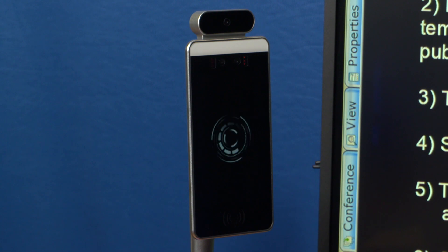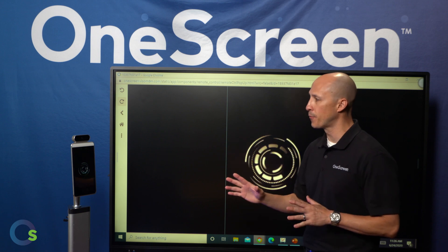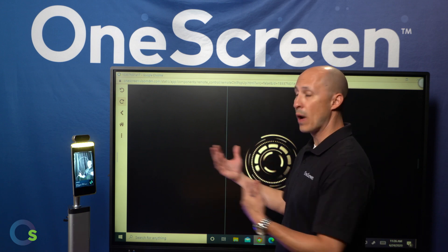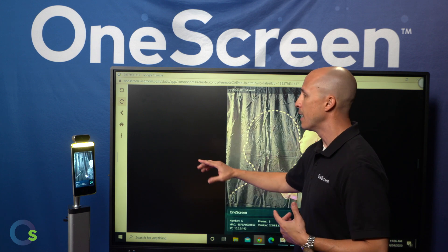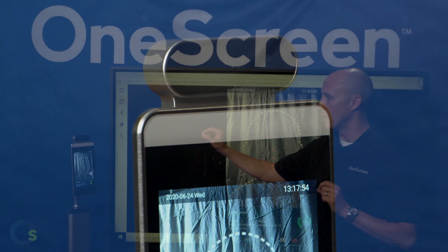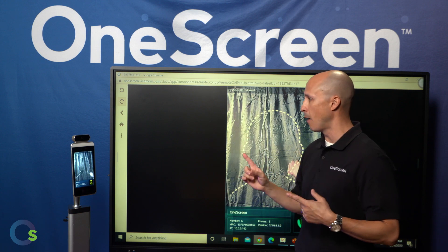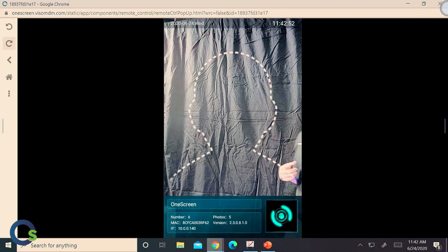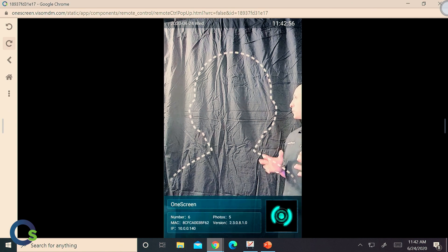Let's take our OneScreen GoSafe for a quick test drive. As soon as you get in front of the screen, it's going to recognize you and basically turn on. What you'll notice is that the LED light bar automatically turned on. The nice thing with that LED light is that as you go through the scanning process, it will have different colors depending on the outcome. You'll notice there's a white outline that you're supposed to put your face into.